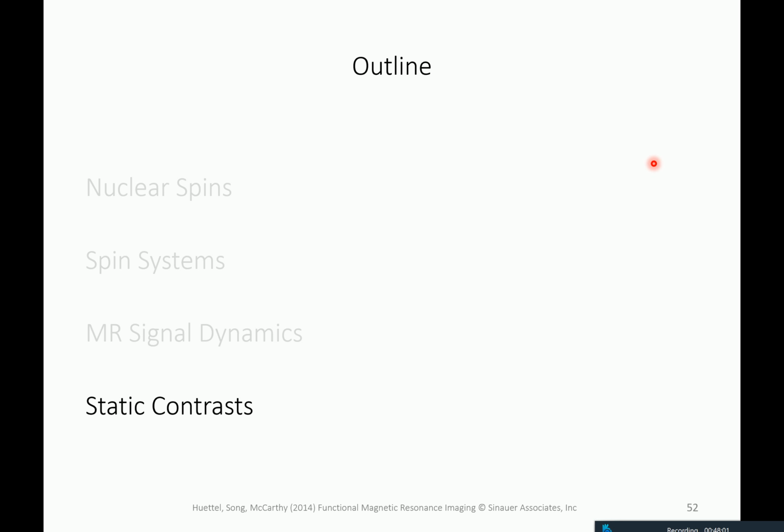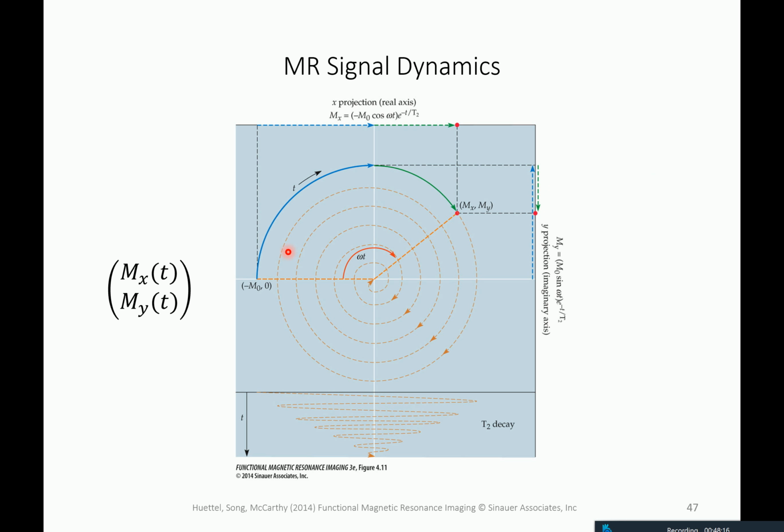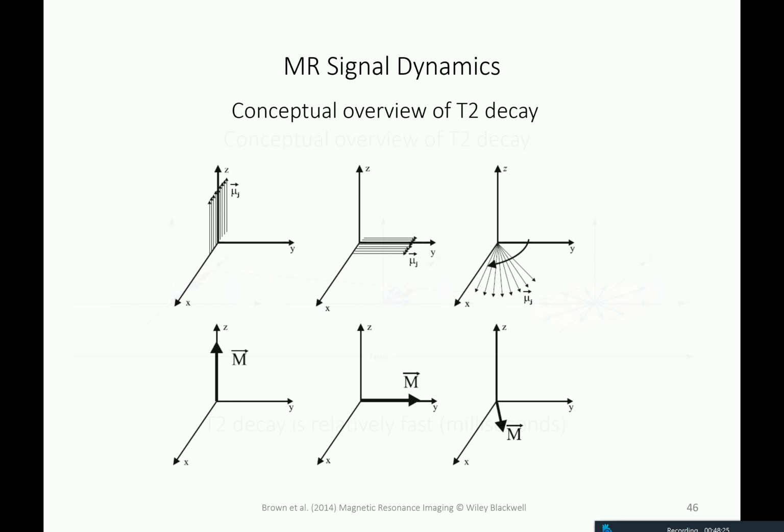One quick question. When you're talking about the amplitude getting lower, could that be seen as the length of the vector? Yeah, this is exactly what I mean. You can also see that here. If you go from the middle, so that's 0,0, to xy, and you look at the length of the vector, it's getting smaller. First it's long, and then it gets smaller. So the length of the vector and the amplitude would be the same. Yes.